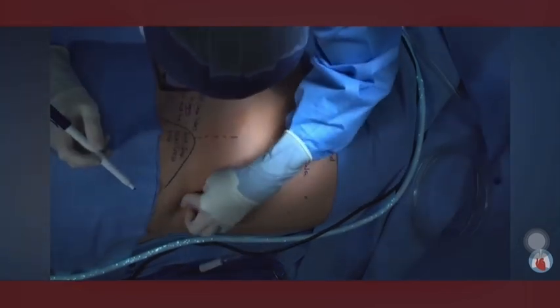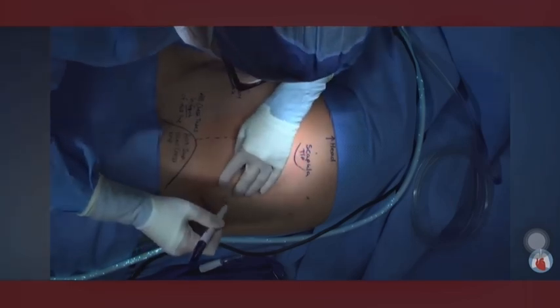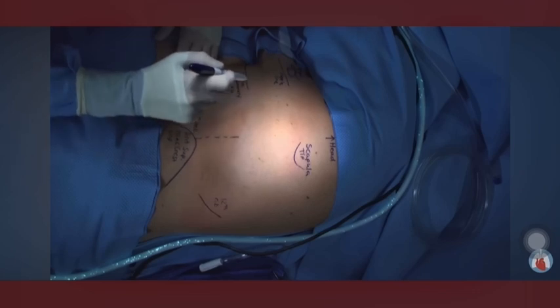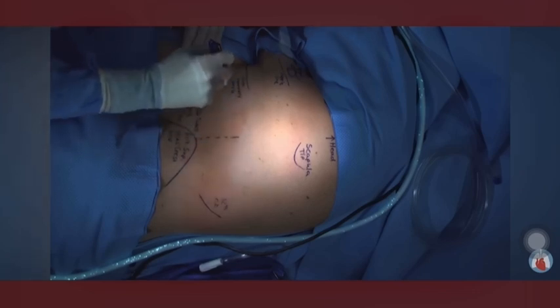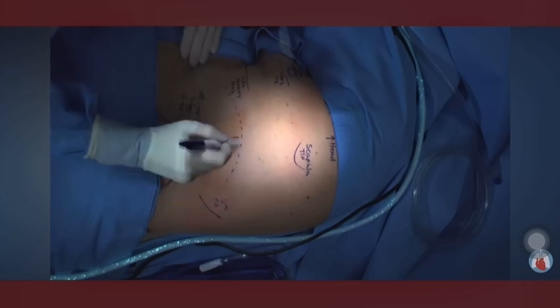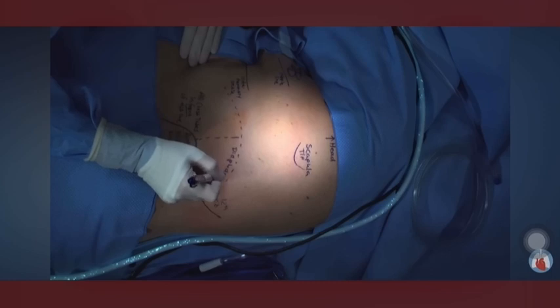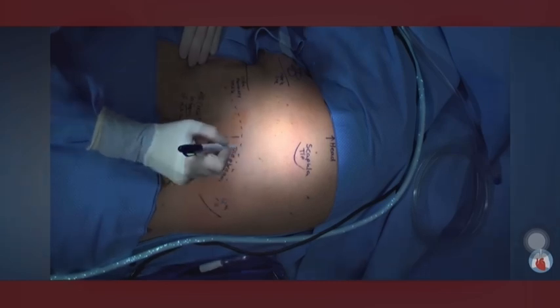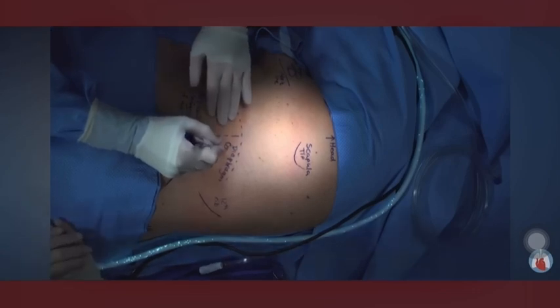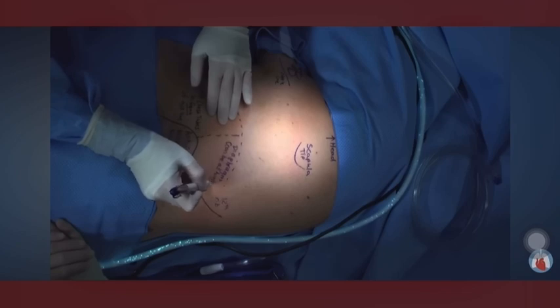Next, identify the 12th rib. This is going to help you approximate the lie of the diaphragm. Remember that the dome of the diaphragm can be as high as T4 or even more elevated in certain disease processes. These can include diaphragmatic paralysis, diaphragmatic eventration. It is essential to know your patient's history and to review your radiology very carefully before beginning your procedure. Sometimes having the chest X-ray on the screen in the room is also very helpful.